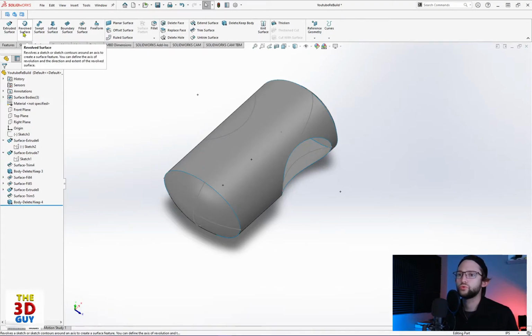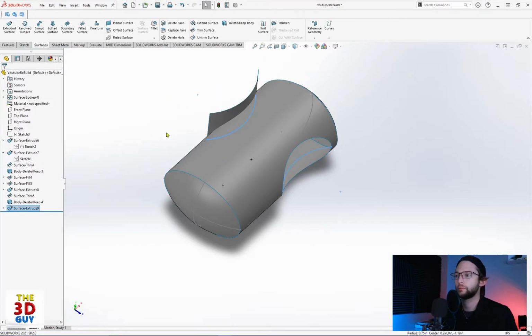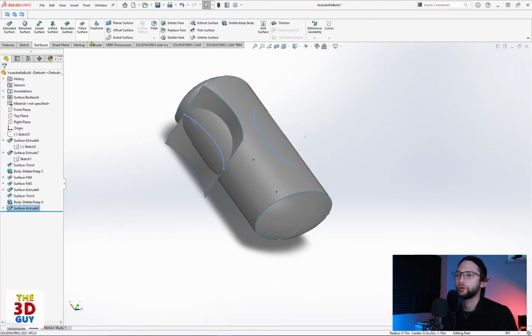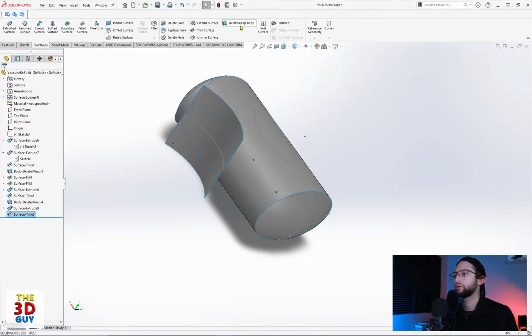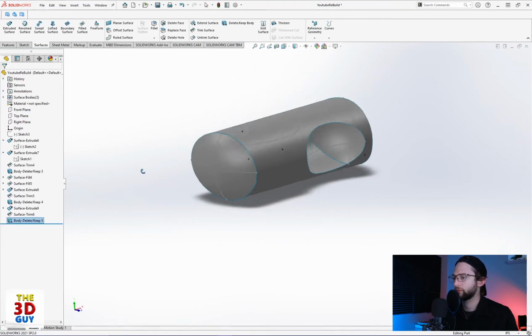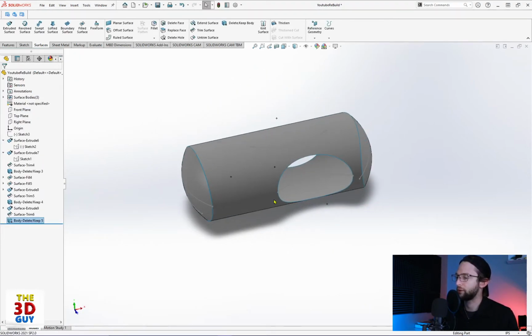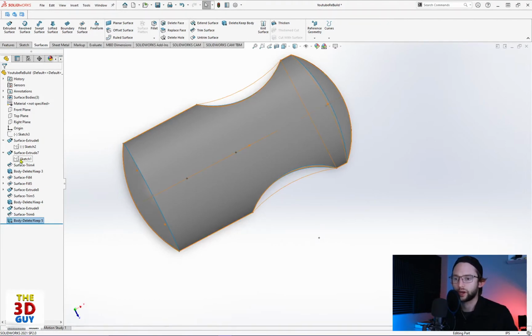We're going to extrude. Create midplane. And we're going to trim and delete. And again, there's lots of different ways that I could go about making this. So you can see we're actually missing the curves that we're going to need. So we're actually going to bring back that sketch right there. And I'm actually going to do a new sketch.